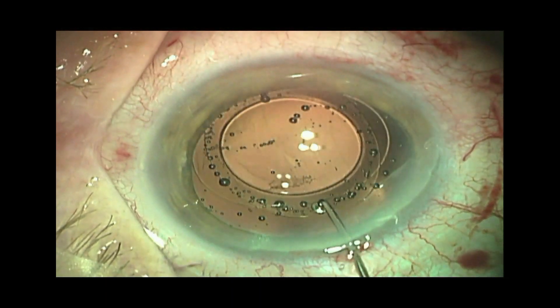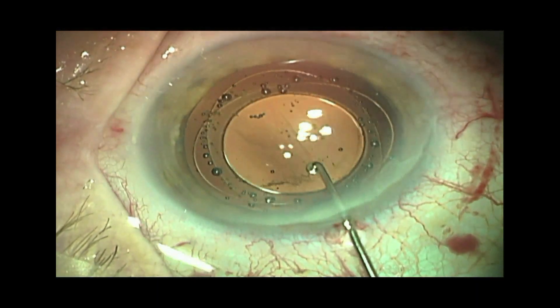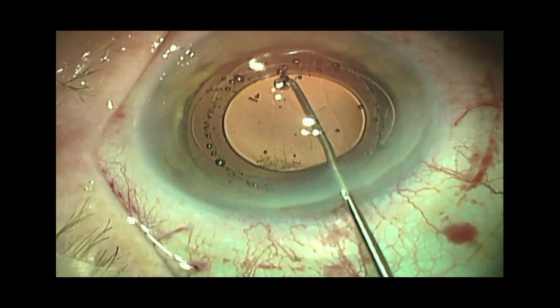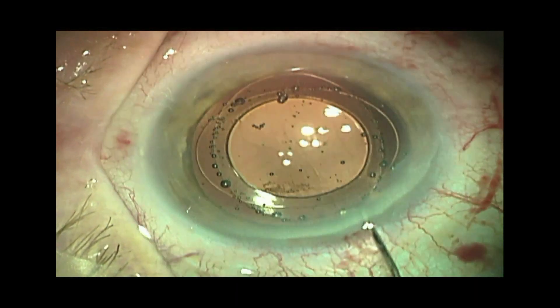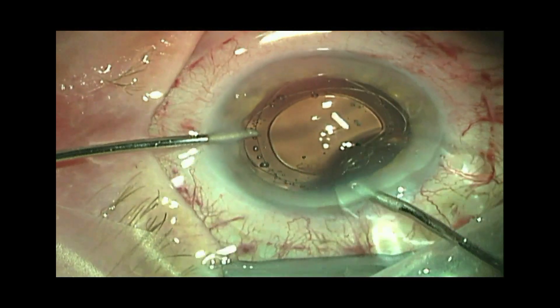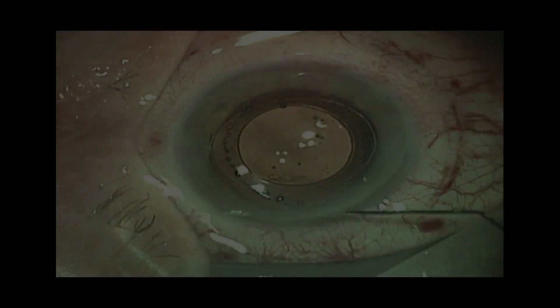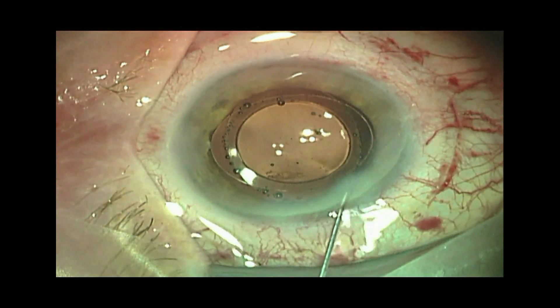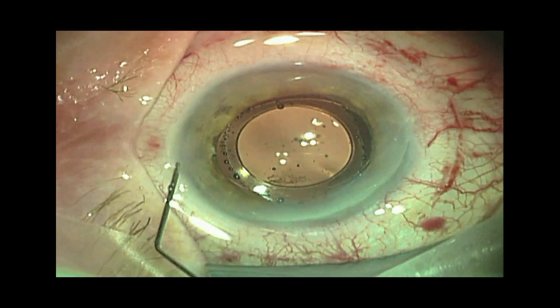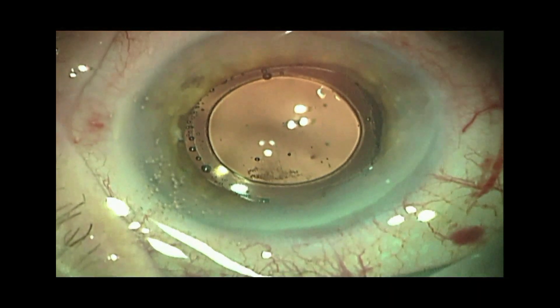The greatest published advantage of the bag-in-the-lens technique is the absence of posterior capsule opacification in adults. However, the posterior capsulotomy has been criticized as too difficult to manually perform on a routine basis, as it must be centered with the anterior capsulotomy and at the same size for good results. The main advantage of the image-guided femtosecond laser-assisted technique is the safety and reproducibility of creating perfect anterior and posterior capsulotomies with proper size, centration, and symmetry. We have successfully used this technique in 31 cases with no complications during or after surgery. This laser-assisted technique using the Catalyst system has great potential to further improve post-operative outcomes and helps us attain our ultimate goal of complete patient satisfaction.